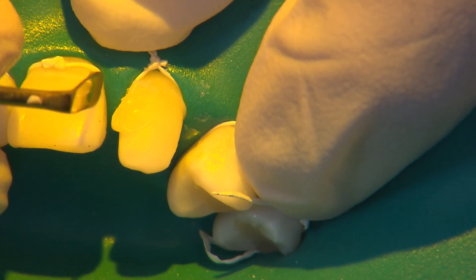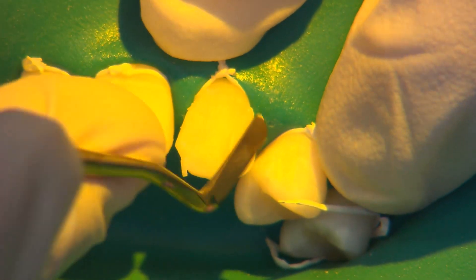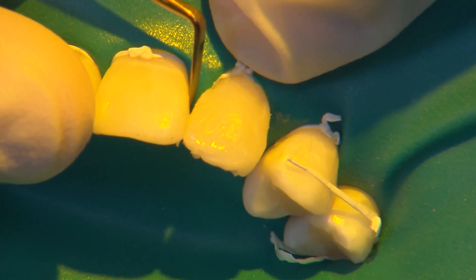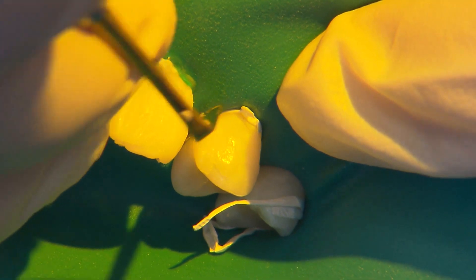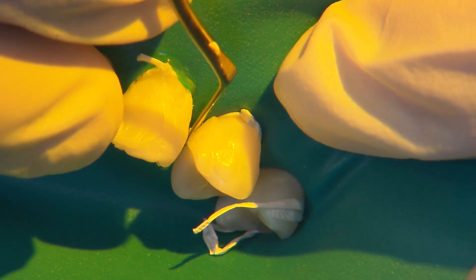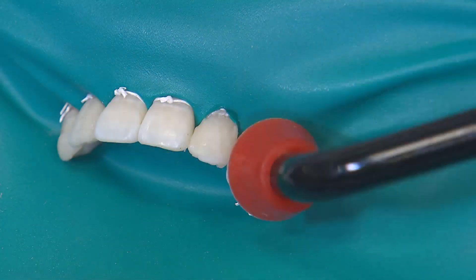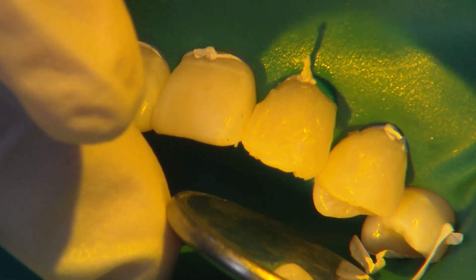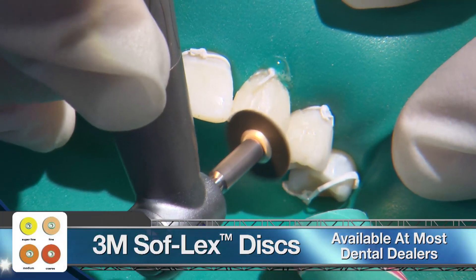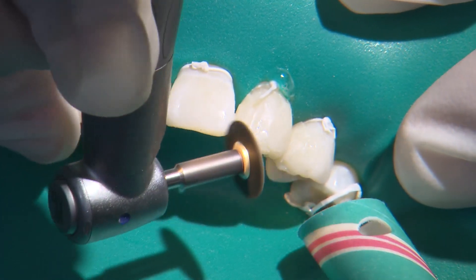In the aesthetic zone, I try to shape the resin close to the final contours as much as possible, but slightly over-bulked. Rather than spend too much time smoothing the restoration during the resin application, I find it a bit faster to dial in the final contours during the polishing phase. Camouflage Universal has desirable properties that benefit both myself as the clinician and the patient — it's easy to manipulate intraorally, has great wear characteristics, is very stain resistant, and has one of the lowest water sorption rates on the market. Water does not easily diffuse into the polymerized composite, avoiding degradation and allowing it to maintain its mechanical properties for a longer period of time. Here I'm using a soft flex disc, the coarse variety, to shorten the length of number 10 by about half a millimeter.